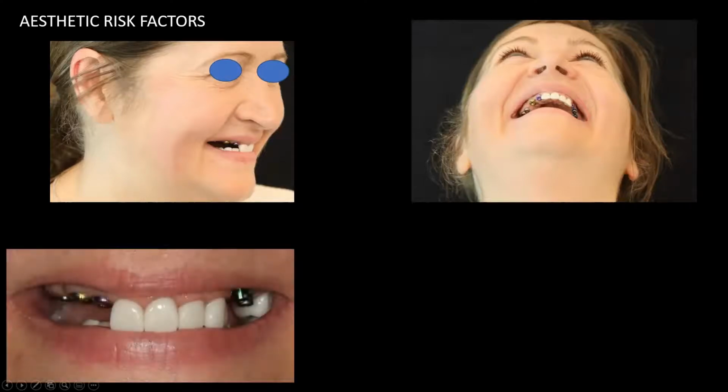Okay, this is an issue. You have a high smile line. That's not high enough here. You have a high smile line. How are you going to get the level of aesthetics in this particular patient? Not the right side or left side. How are you going to get that right? Well, you've got those 4 front teeth that you're dealing with as well. So what are you going to do with them?